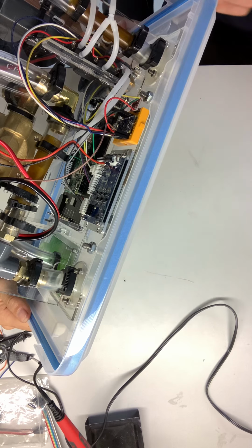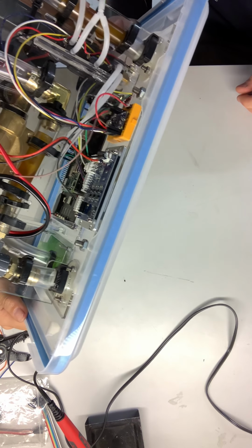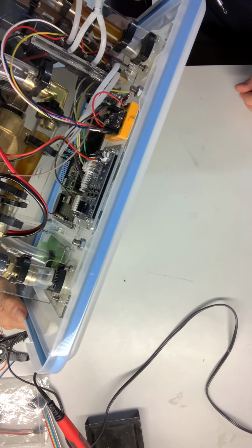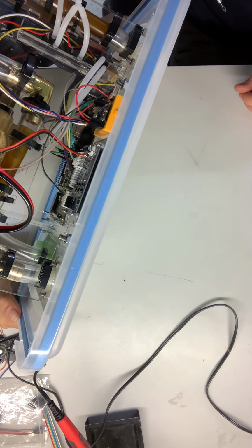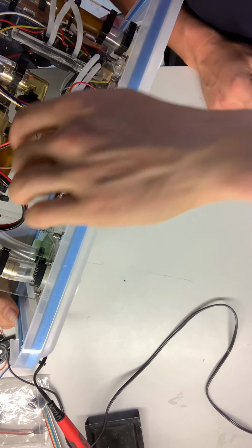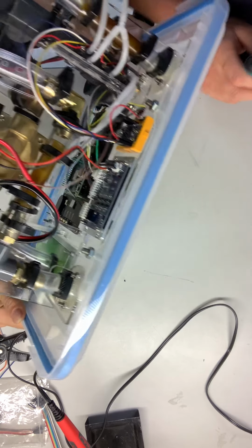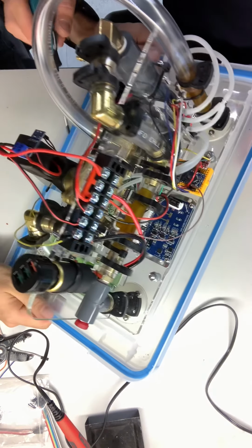Okay, and let's just check the RPi then real quick. Do power signals. We did red is the power, and brown is ground. Yeah, brown is a ground. So it's grounded twice, technically. Yep. Whatever. That's fine. You can never have too many grounds. Okay, well, you can, but... Okay.